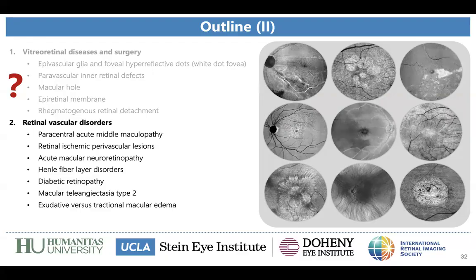The easiest way I can think of is to manually adjust the segmentation: point by point, select the layer you're interested in, select the thickness of the slab, and go from there. Of course, this is a limitation, and I hope software advancement will help improve this point.